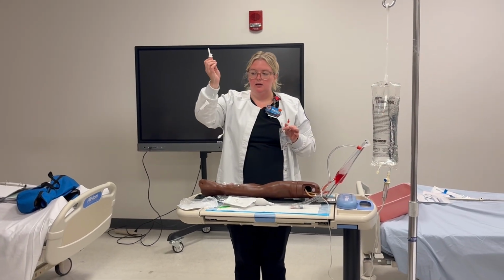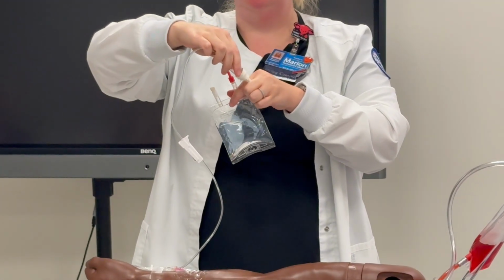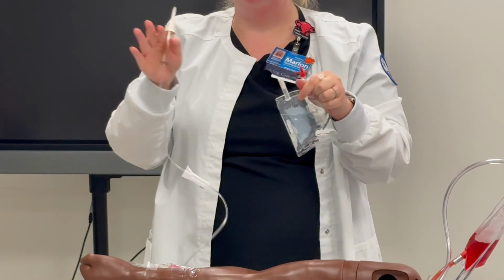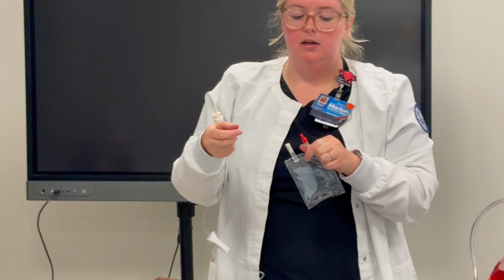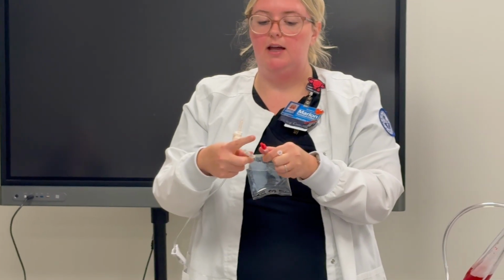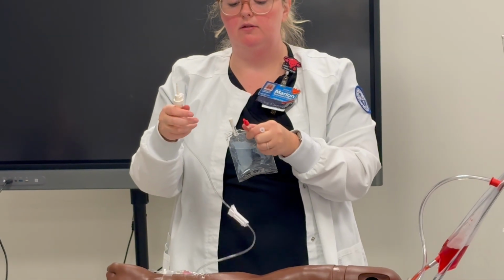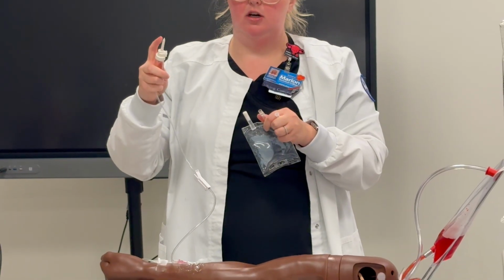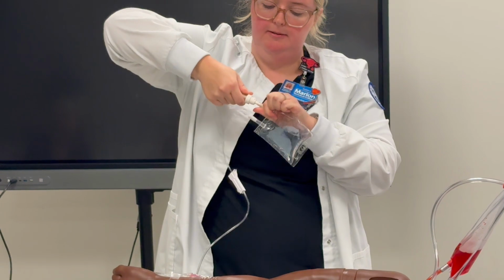So, my tubing is clamped. I'm gonna use the same process, so I'm going to put this in between my fingers. I think I did it a little bit different. You'll figure it out. This is not a skill you can practice one time and know what you're doing. Where do I spike into? Red. In real life, these are typically blue. They're just red for the practice. Okay, take that off. Make sure not to contaminate, push and twist. Okay.